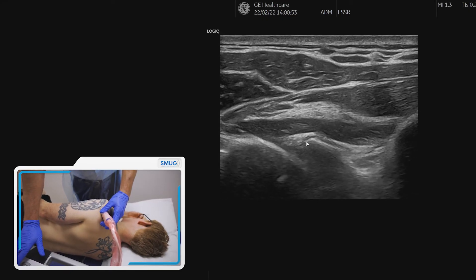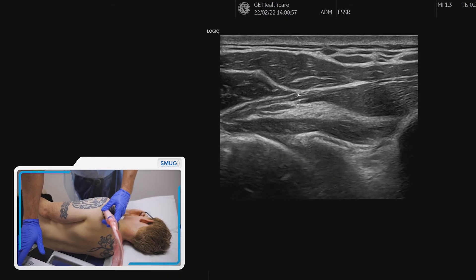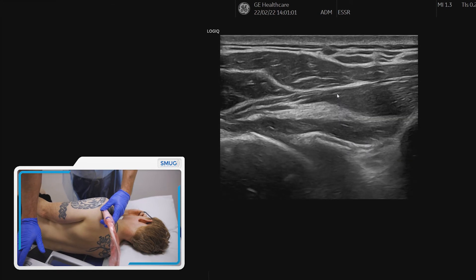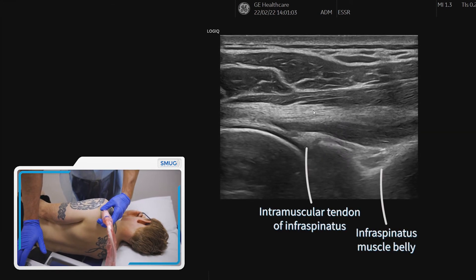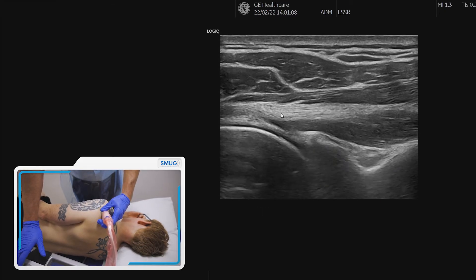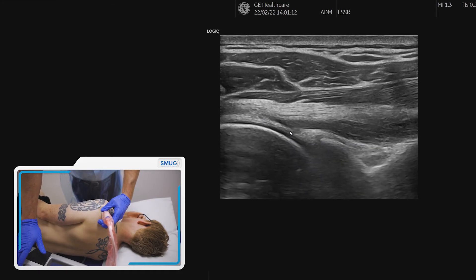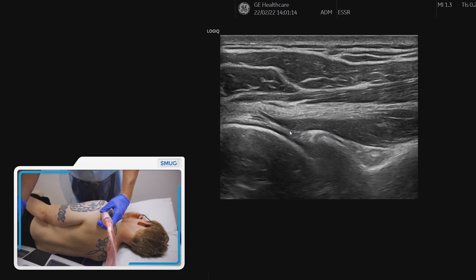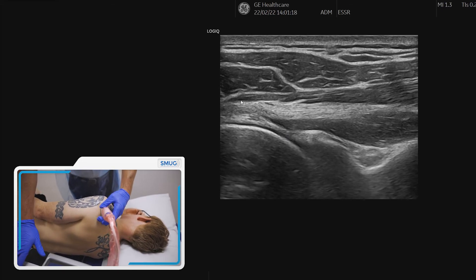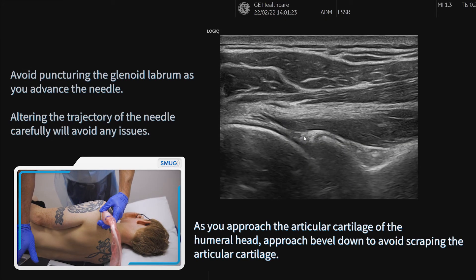The target is obviously between the glenoid and the humerus. Going through the layers: we've got the deltoid, we've got the infraspinatus muscle belly, and through the middle there you can see the infraspinatus tendon. When I first started injecting I was always cautious about putting the needle through the tendon because I thought it might be a bit more sore. I do try and avoid it still, but certainly it's nothing you need to be too concerned about — you can pass a needle through that tendon and it doesn't seem to cause any extra pain.